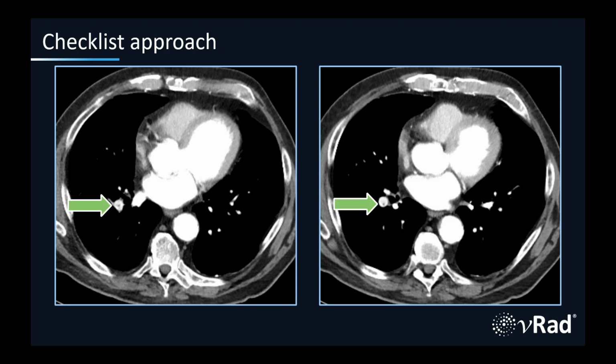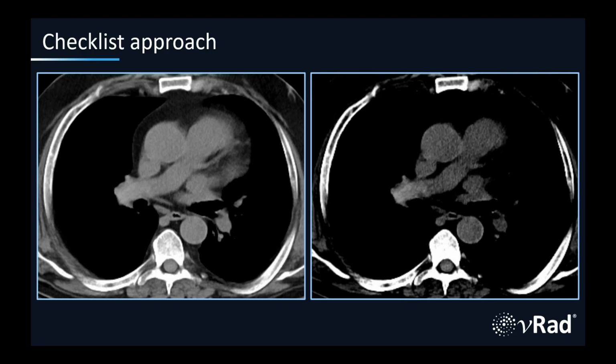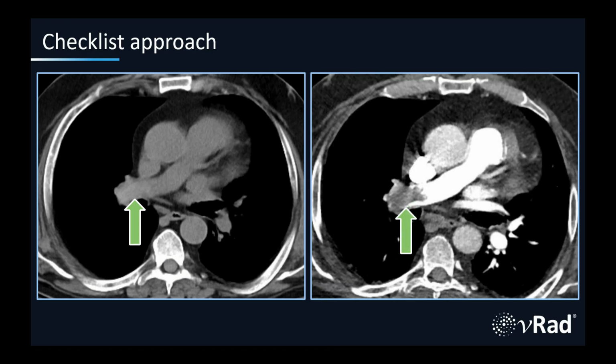Let's see some examples where the only way you're going to make this diagnosis is to look directly at the pulmonary arteries. Here's another case that was submitted for great call. I'll draw your attention to the right main pulmonary artery. There's some subtle hyperattenuation here. If we put it on liver windows, it makes it more obvious. If you put a green arrow on it, it makes it even more obvious. So there were no secondary signs of a pulmonary embolism on this examination, only this hyperattenuation, which you would only be able to see if you were looking directly at the pulmonary arteries. This is the follow-up chest CTA, which shows the thrombus in the right main pulmonary artery.